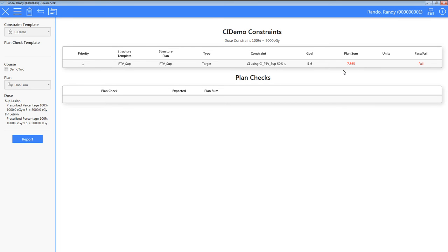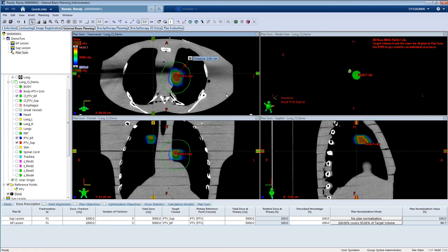It cannot be stressed enough. It is very important when using this setting that you verify all the dose that you want to be accounted for, and that it is included in this structure. If dose falls outside of this structure that is supposed to be accounted for, then ClearCheck will report a lower volume ratio.